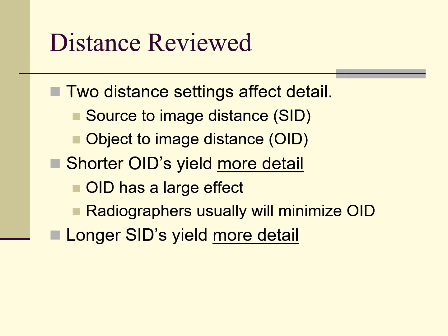Finally, longer source to image distances will also maximize detail or decrease magnification, but in many situations, long SIDs are impractical, such as in tabletop work. Standard source to image distance for radiography is 40 inches to the table and 72 inches to the bucky. We have experimented with different distances, but 40 and 72 seem the standard across the industry.